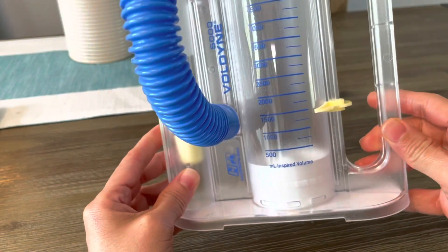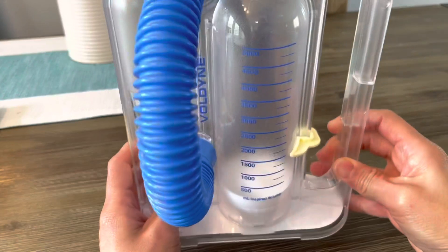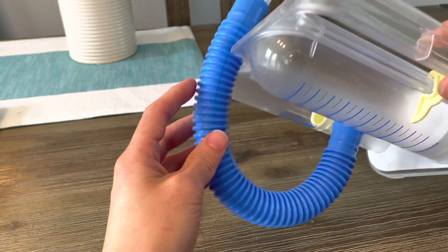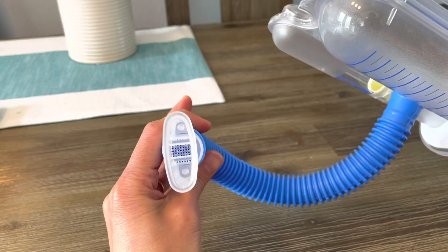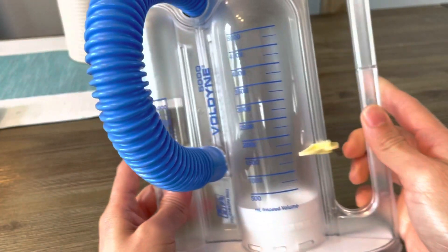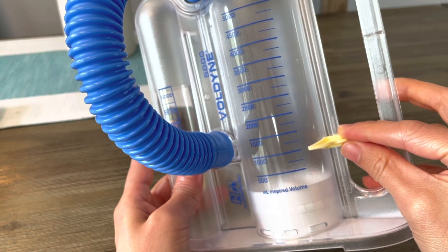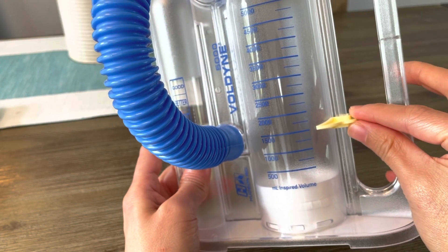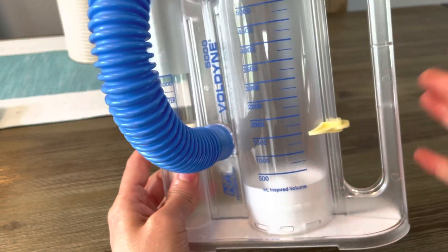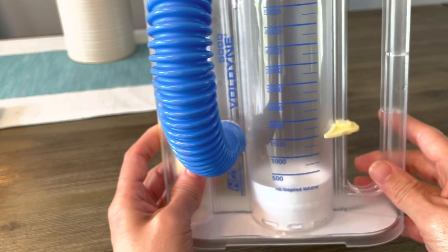The incentive spirometer is made with plastic — it's very light. It has a handle, tubing, and a mouthpiece. You have your numbers and this is the marker where you set your goals. Your goals depend on whether you are male or female, how old you are, and your height.